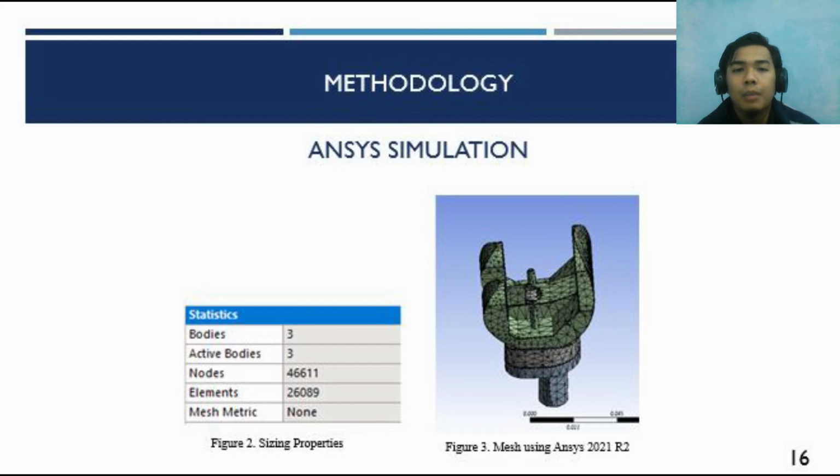The geometry is imported from the design modification, which consists of three component modifications, which are the femoral, tibia insert, and tibia. It is made using CATIA software, in which the final product file is converted to a .stp file. The contact region between the tibia insert and the femoral component was determined as the critical connection. The meshing process was manually assigned to this assembly. Meshing analysis has the effect of increasing design precision, convergence, accuracy, and simulation speed.